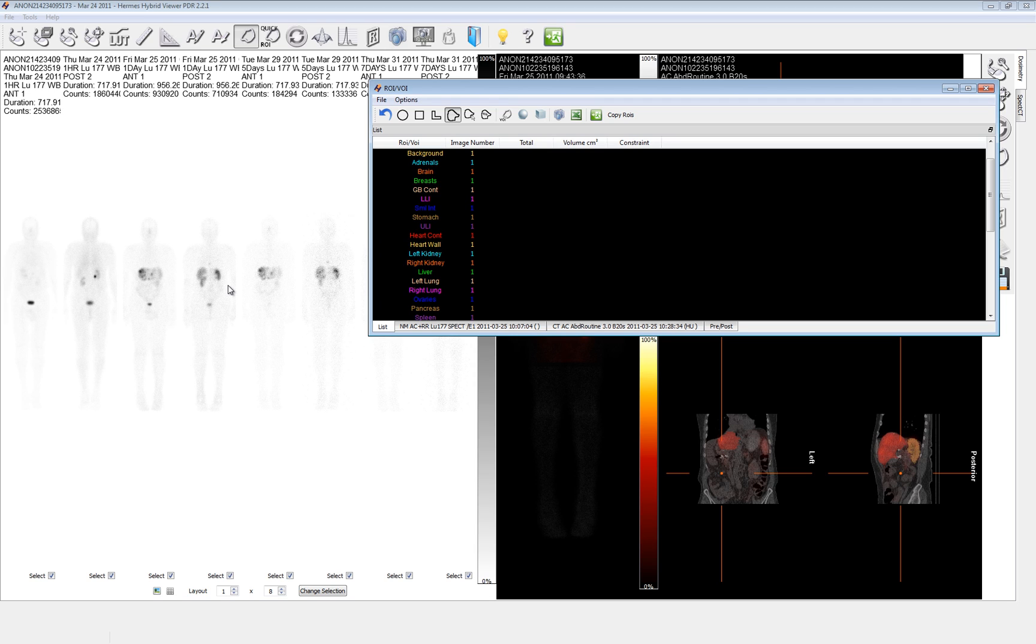The rest of the activity then is distributed throughout the rest of the remaining body in the S-factor phantom. And so anything that has a relatively normal or equivalent to the rest of the body non-significant activity concentration will be treated with the activity concentration that's left.